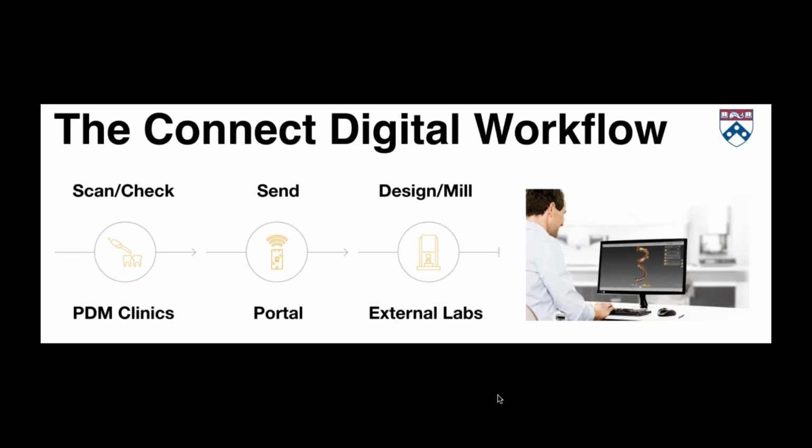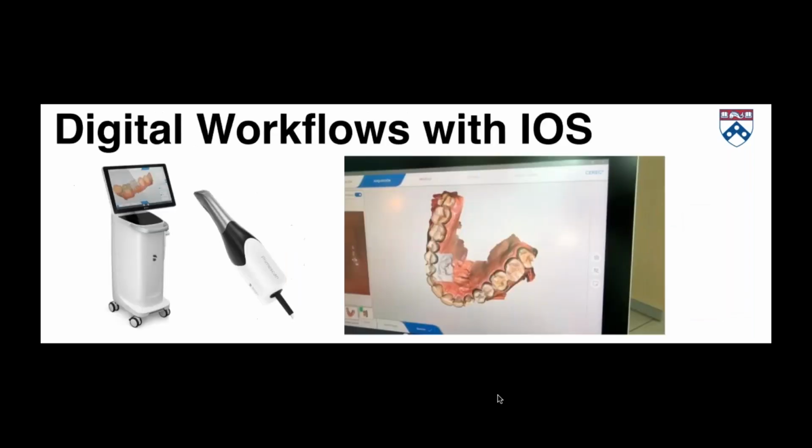So basically today, I don't believe in not doing a digital impression. That's the only type of impression that I make. And then, of course, having quality control of what I make the digital impressions with, and then sending it to these different labs and having the experts do what they are better at. I think that's what makes a really nice combination.